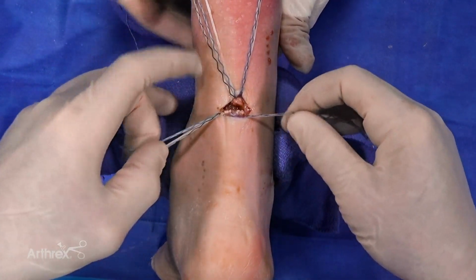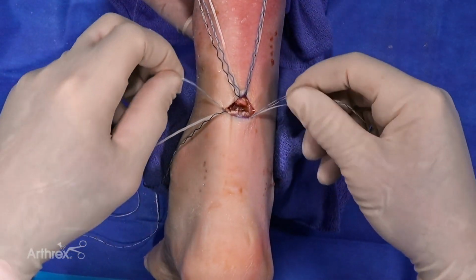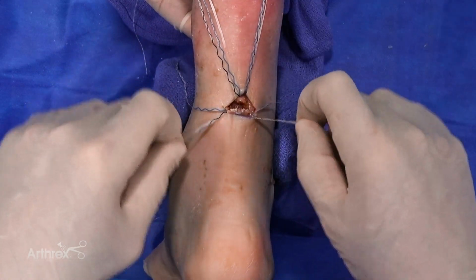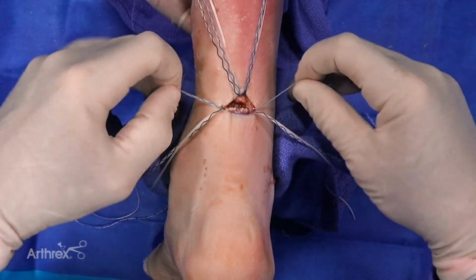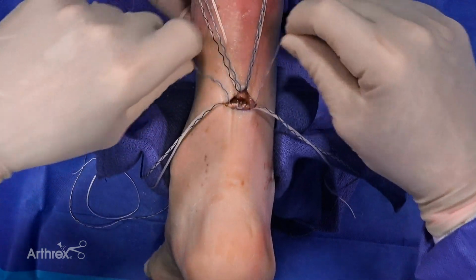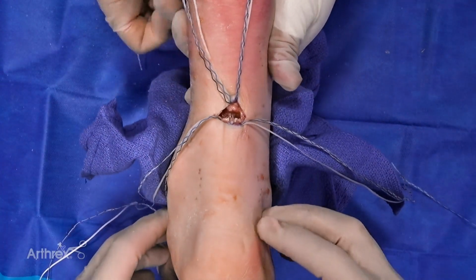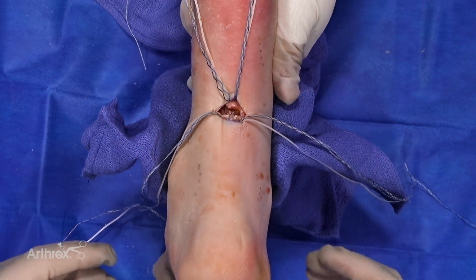So now you can see we've got all of our sutures placed. Our blue is our locking, our white and our black are our straight transverse non-lock sutures. It is important to test all of them. So I'll go ahead and I'll test them, I'll secure them. Now at this point our sutures are in place, they're secure, we're ready to go ahead and secure them.